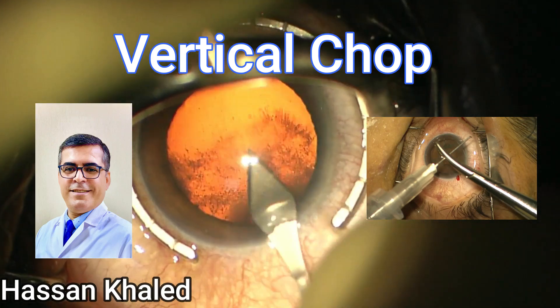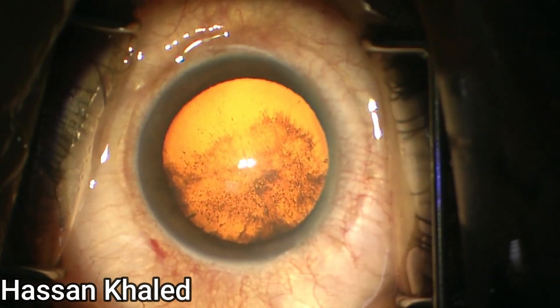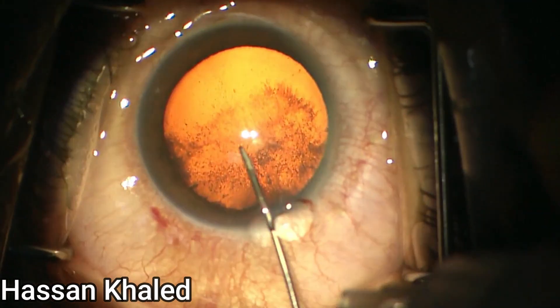Vertical chop technique for moderate dense cataract. Here I am presenting a case of phacoemulsification for moderate dense cataract.